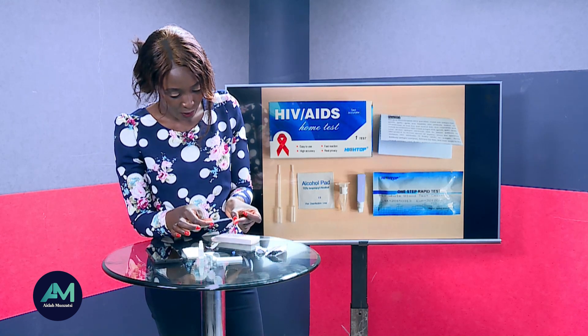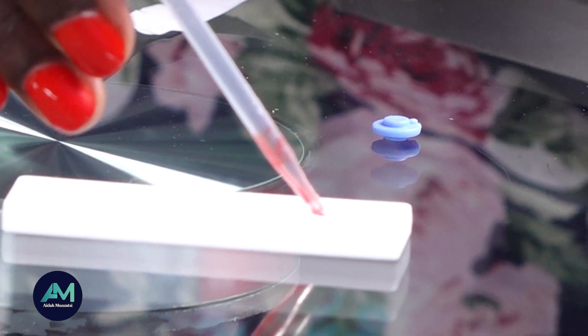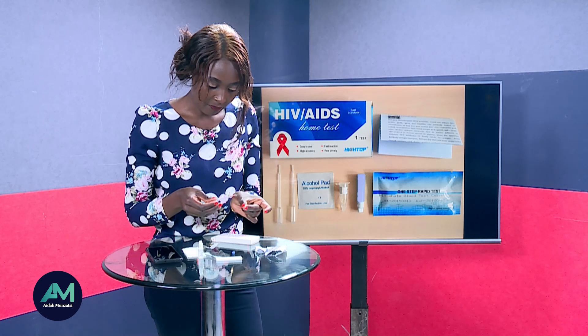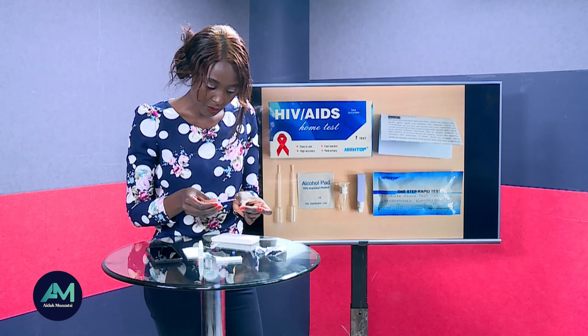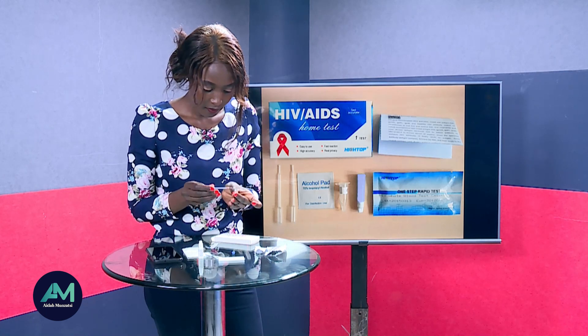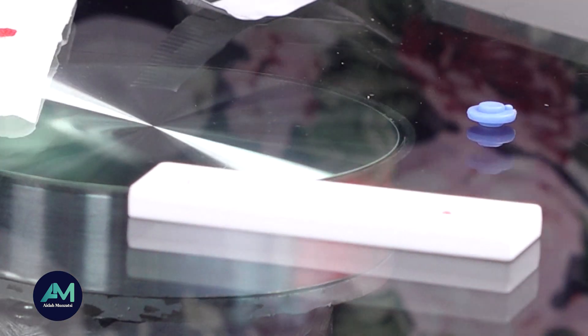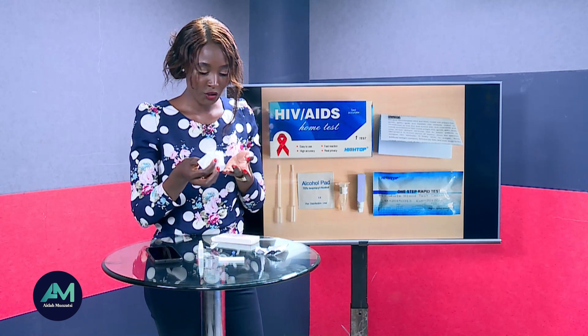Press the pipette and collect the blood sample, then drop one drop, wait, and drop another. Massage the place again if needed — do not press — and pick up another sample and drop it. Put the pipette aside and use the tissue to absorb the remaining blood from your finger.